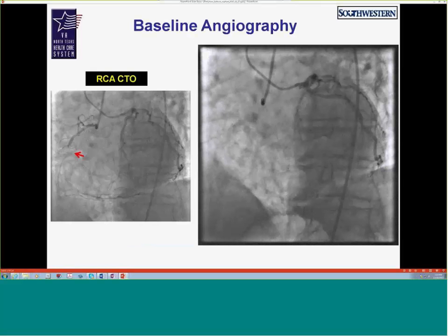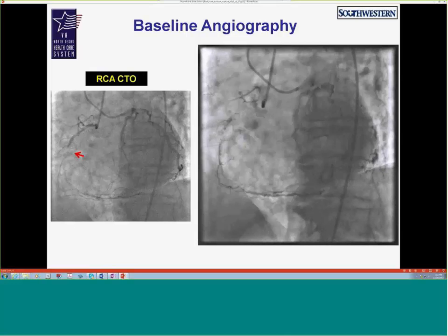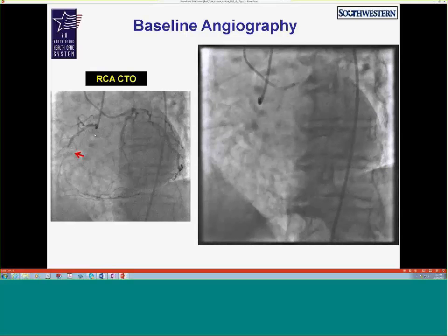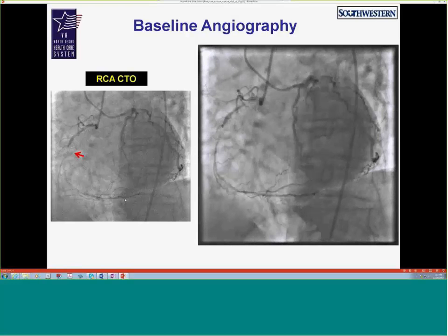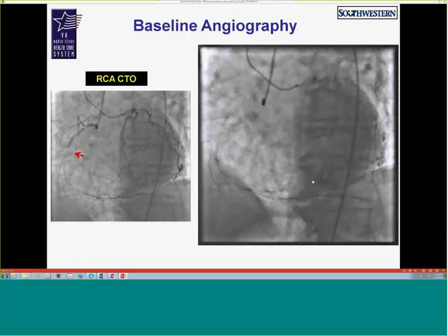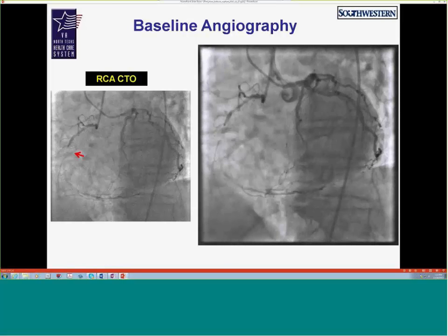Okay, so this is the first case. This is a case we did about a month ago, right after American Heart. And this is a case you can see here, right coronary CTO. It's fairly calcified and seems to have some good collaterals from the left coronary.